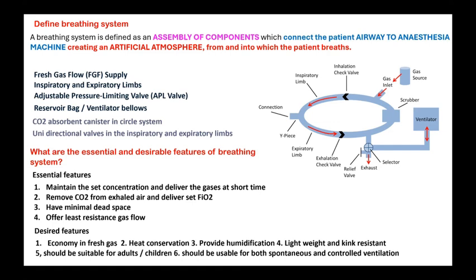It's shaped elliptical instead of being round like a football because it is easy to grip, especially when you do manual ventilation. Earlier days, nowadays you are all using ventilators in all your workstations. As soon as you intubate and then connect the patient to the circuit, automatically your hands go to the ventilator and you switch on the ventilator, and you have very little experience of ventilating the patient with the reservoir bag.